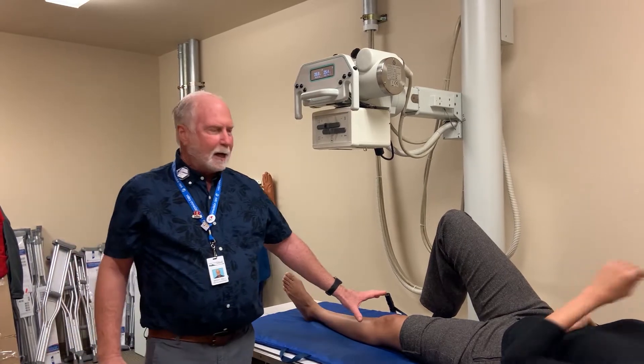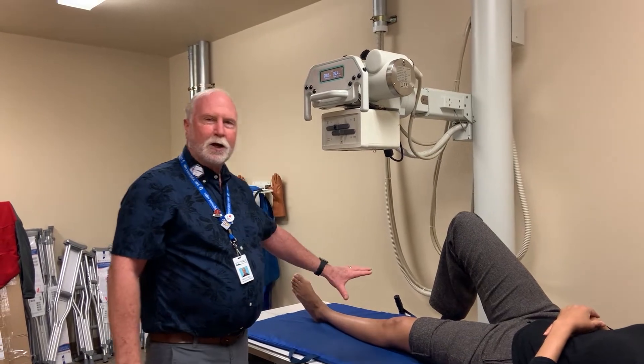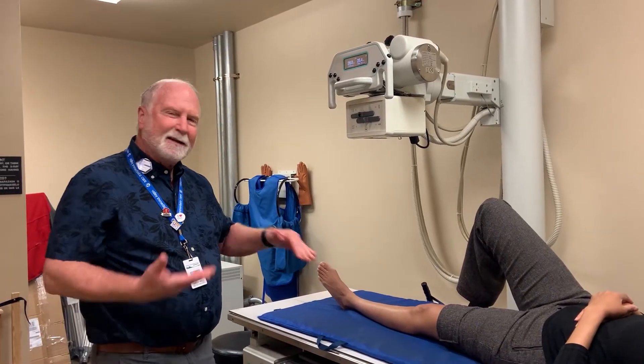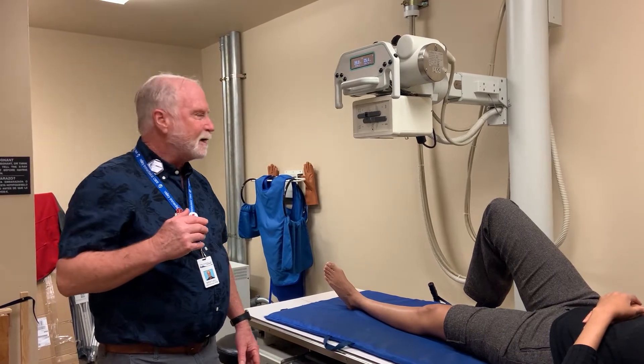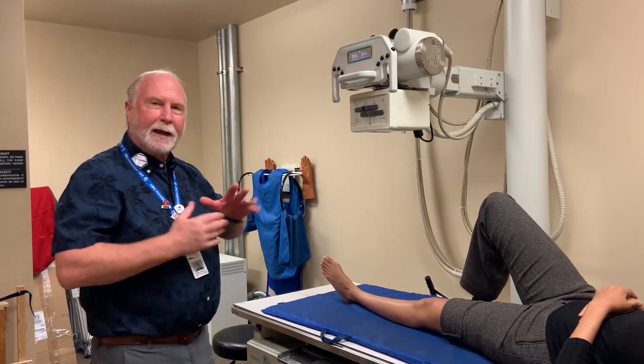Once you get to a knee, the knee is large enough that we want to start using a bucky. When you're doing the tibia, fib, ankle, toes, and feet, you're not going to get enough bang for the buck to use a grid. Once we get up to the knee — plus or minus 10 centimeters — we're going to get enough value from the grid to justify the distance and the extra exposure.